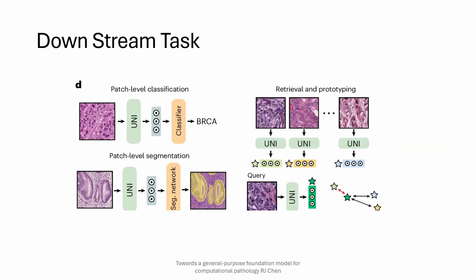And they have applied it to different types of downstream tasks. One is retrieval, because if you have a patch, you send it to the model and it should find other patches of the same type, the same things learned. They also used classification, and segmentation also.